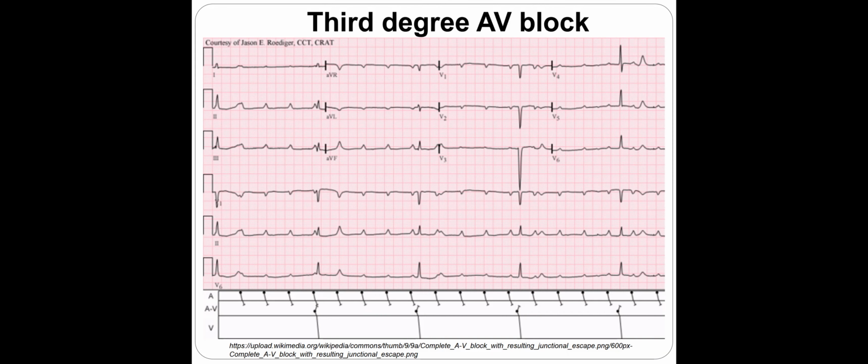So let's say in a premature ventricle beat, very commonly you can see the negative P wave. However, if you do have a third-degree block, there is no way that you can see it. What else? Especially when you do have a 2-to-1, if the conduction goes backward as well, only one problem: the atrium is relaxed, so it cannot accept the charge. What else can you use?